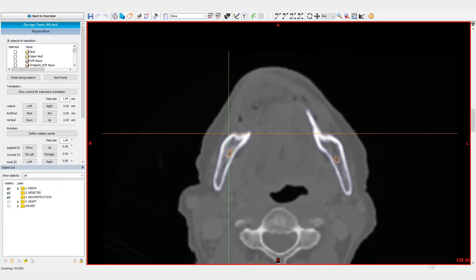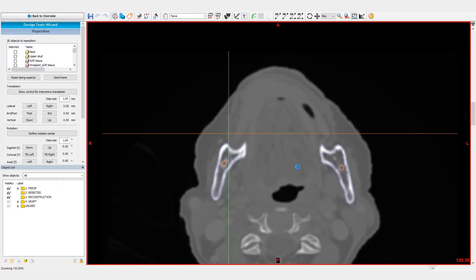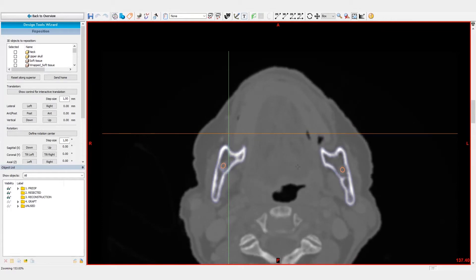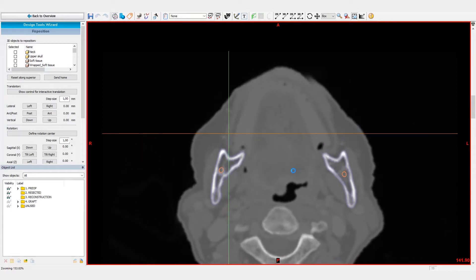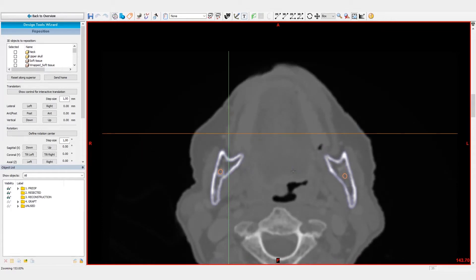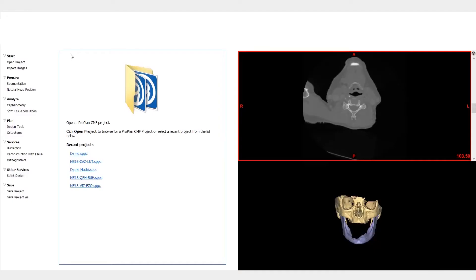First, we will perform the resection. Then, we will mirror the healthy side to the contralateral side. And finally, we will reconstruct the mandible with the Fibula segments.